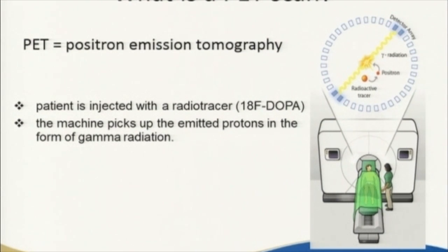The radiotracer would travel to the areas in the body that are going to pick it up, and the pancreas happens to be one of those areas. Also the liver, the kidneys, and the brain. And since we're interested in the pancreas, we just image over the pancreas, and you'll see some pictures shortly. So again, the radiation comes out of the body and hits the detectors. And we can use these special computer algorithms to figure out exactly where that radiation came from.